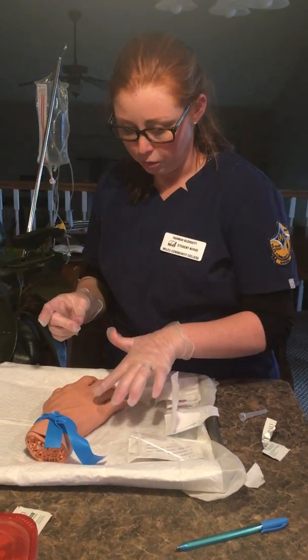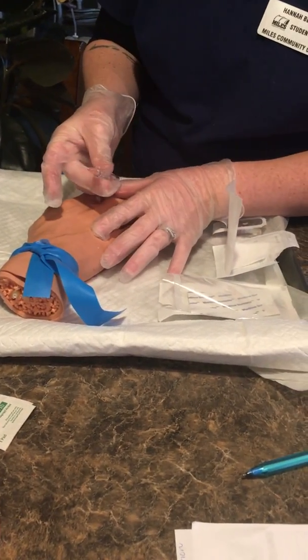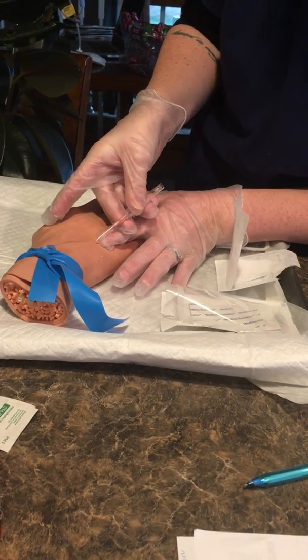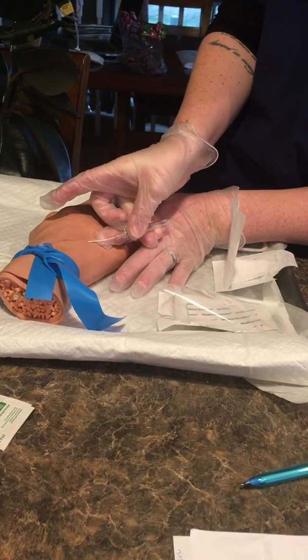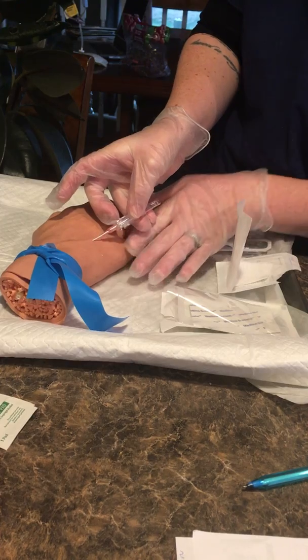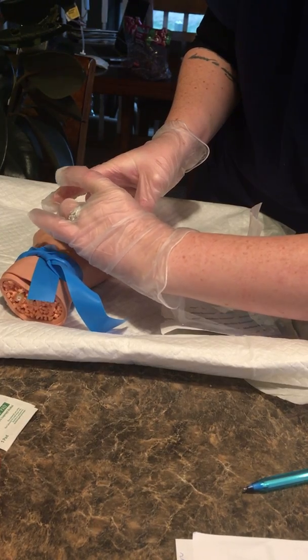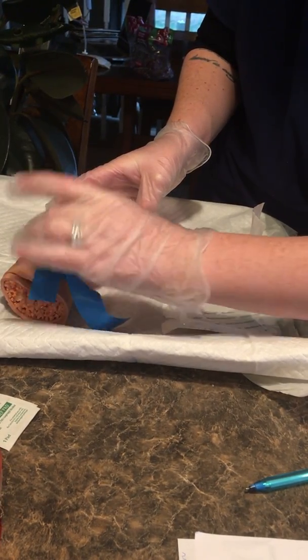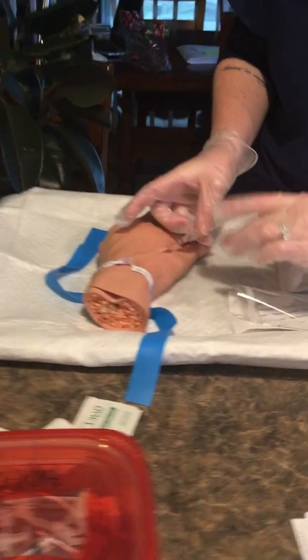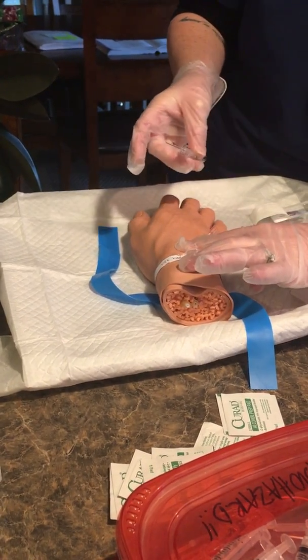I want to anchor the vein and insert at a 30 to 45 degree angle, right above or beside the vein, bevel end up. Once I get a flash, I can go ahead and advance the catheter, release the tourniquet, and take out the needle. I'm going to keep my finger here to make sure it's inserted and also to stop the blood flow so we don't have a big mess.